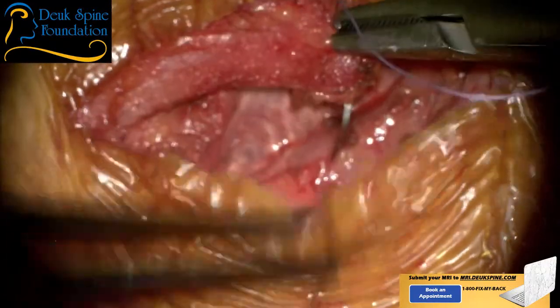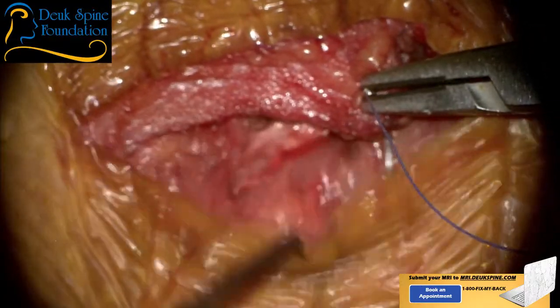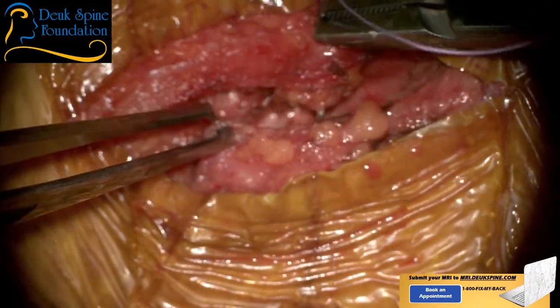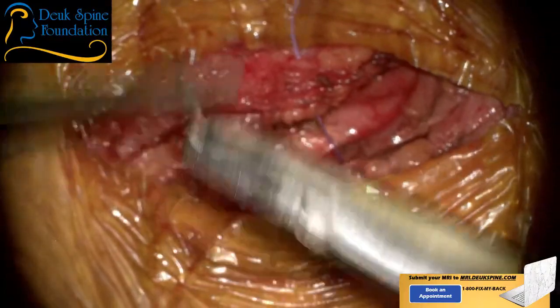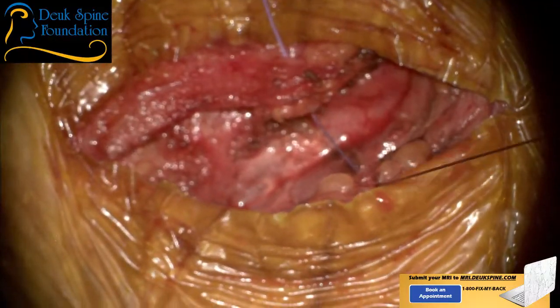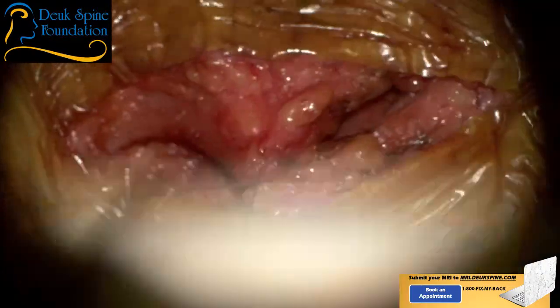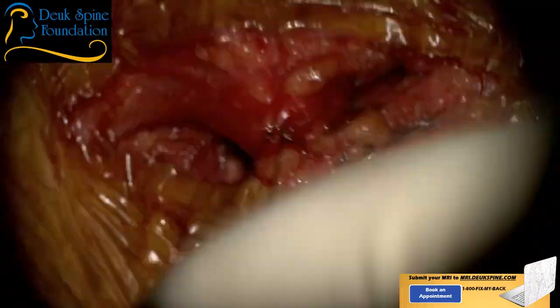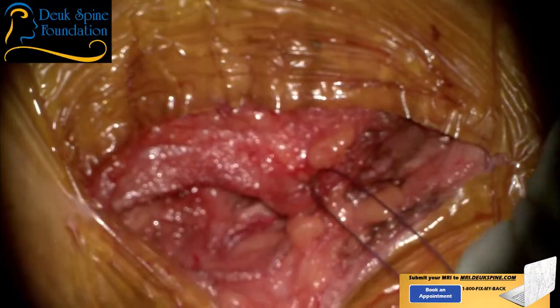I'll get you started. All right, so you got to find the platysma. Do you see where it is? It's literally right there. It's a little purple, you know? You want to tie? Are you able to tie? All right, here. Give Dr. Patel the suture. Yes, I'll tie for him. You need a pickup? So this stitch does not have to be inverted. It's just a simple stitch.